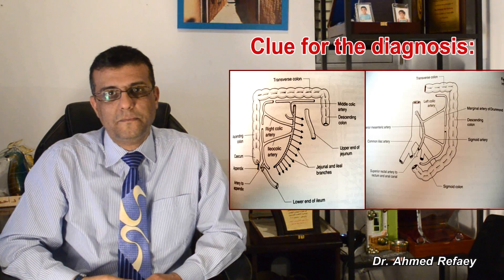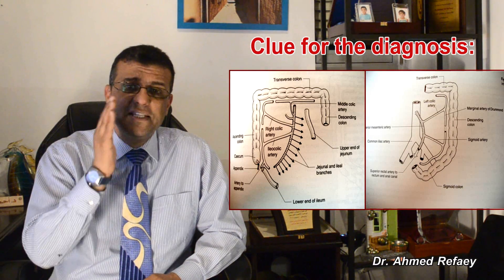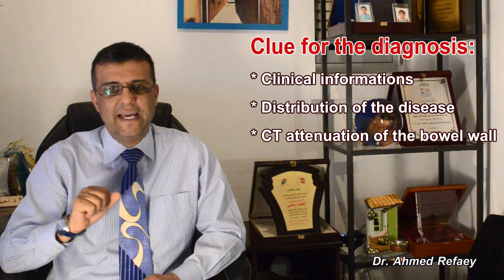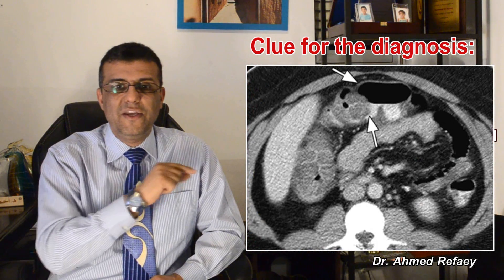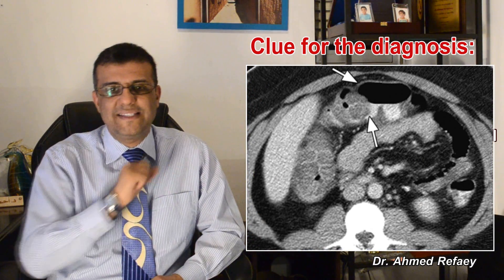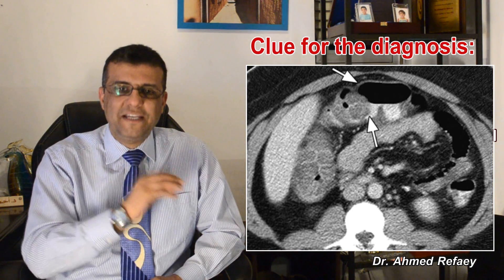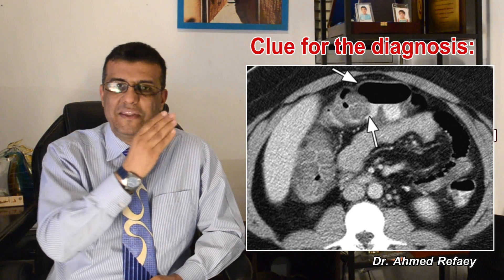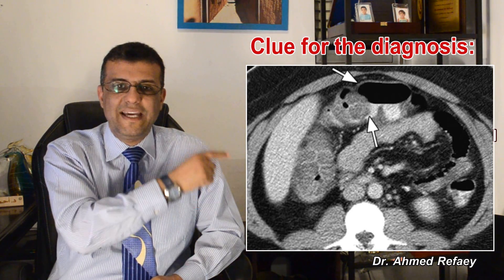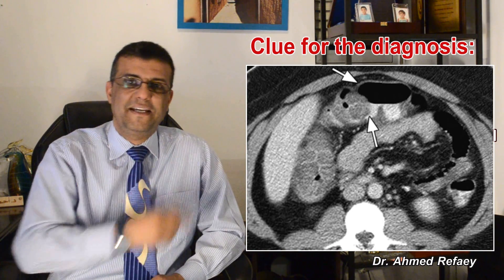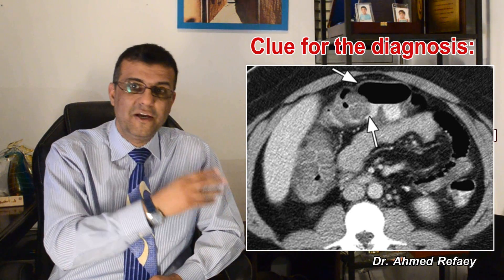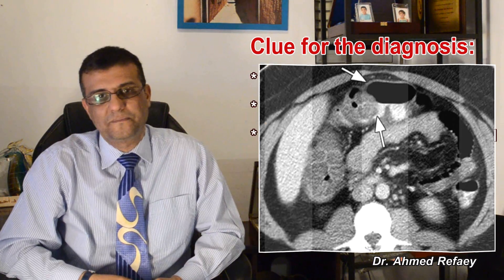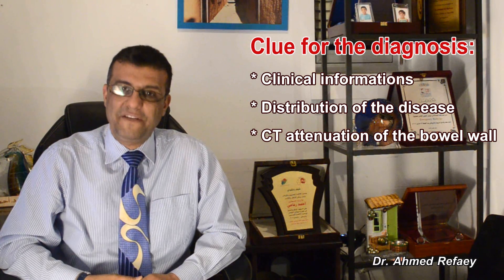The distribution of ischemic colitis usually respects the vascular distribution. As you see in this case, there is marked thickening of the hepatic flexure and the right colon, with an abrupt transition between the abnormal and the normal wall in the transverse colon. This is a typical case of ischemic colitis due to its respect of the vascular distribution.